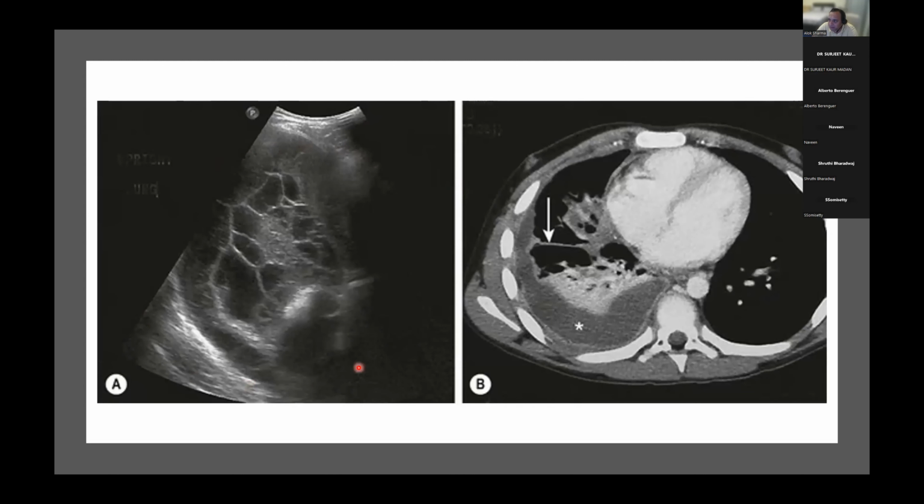I've already discussed that you can see loculated effusions. And really, the question from my perspective is, if you want therapy for something like this beyond antibiotics, in our setup we'd be speaking to our surgeons, possibly our interventional radiologist.